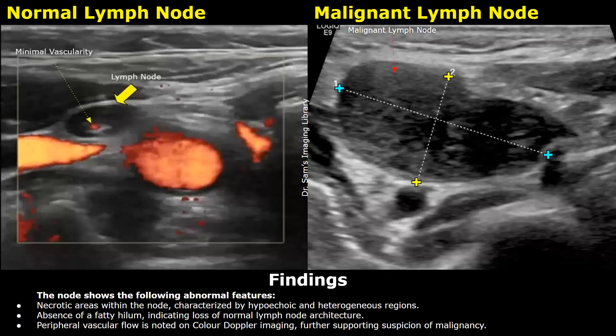The node shows the following abnormal features: necrotic areas within the node characterized by hypoechoic and heterogeneous regions; absence of a fatty hilum, indicating loss of normal lymph node architecture. Peripheral vascular flow is noted on color Doppler imaging, further supporting suspicion of malignancy.